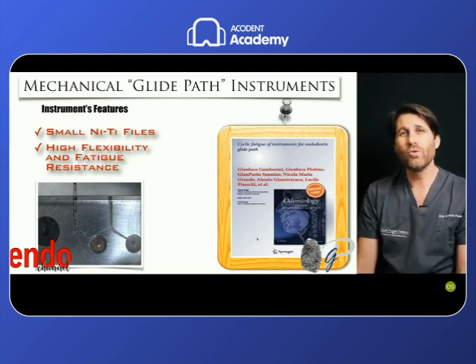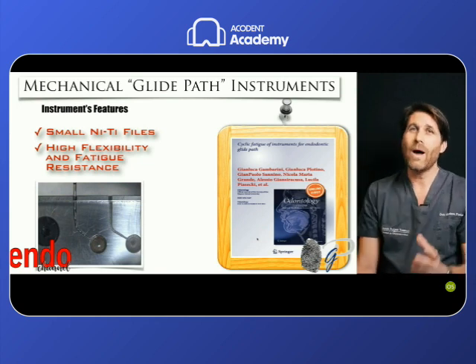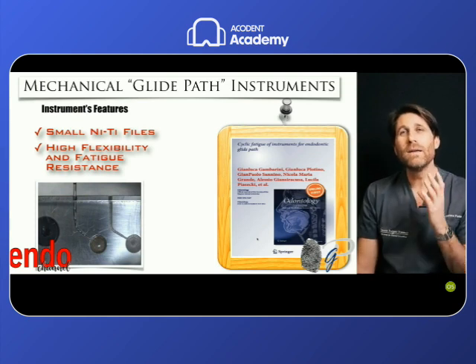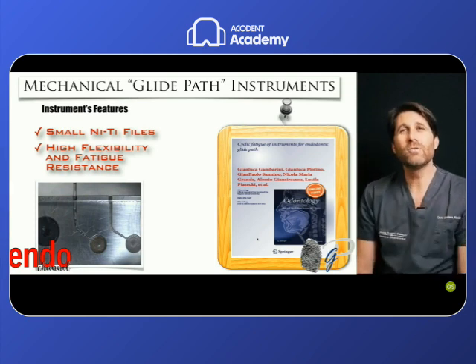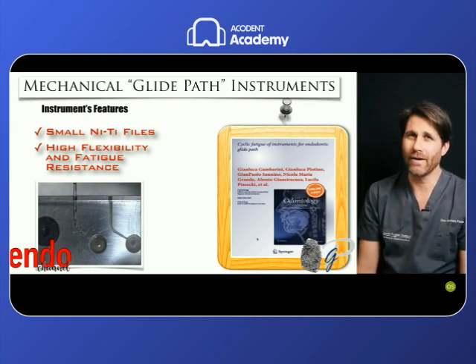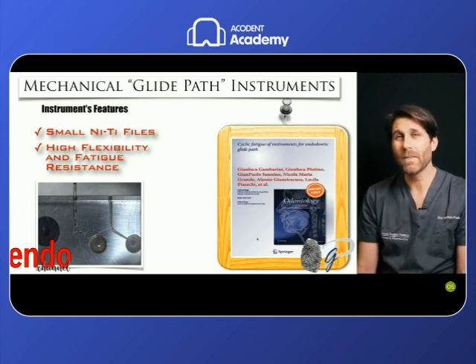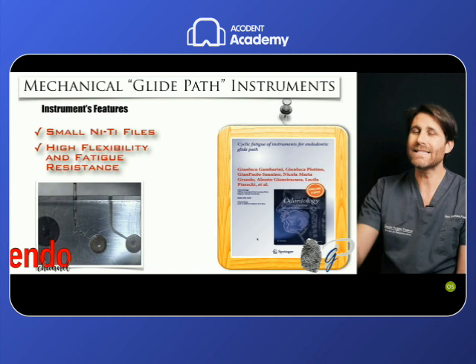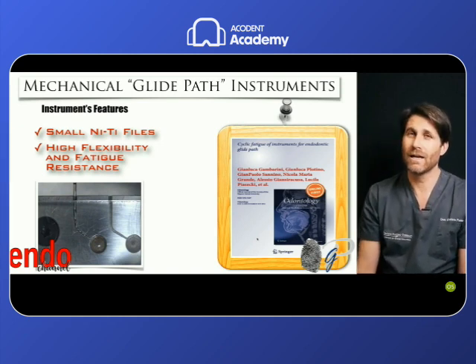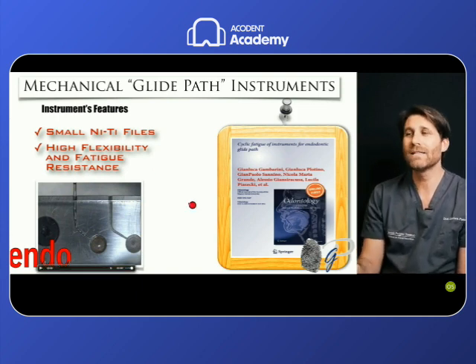Why have we introduced metal treatments of the nickel titanium files? I have explained it in the lesson on the ideal instrument. Because we need to increase the mechanical properties of the nickel titanium mechanical files, their resistance and their flexibility. But in the case of a small file used for scouting and glide path, we have demonstrated that we already have high flexibility and fatigue resistance.